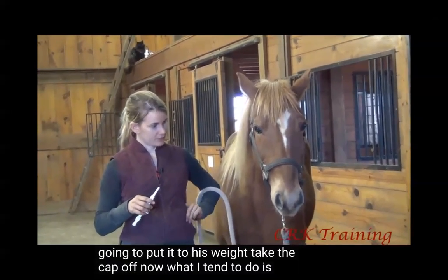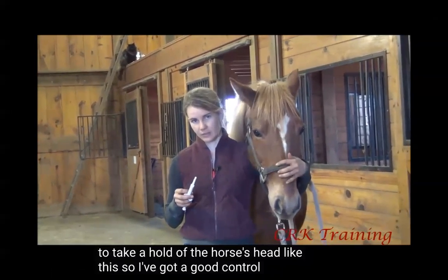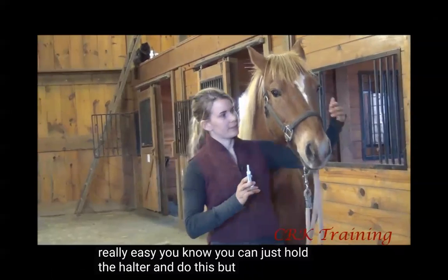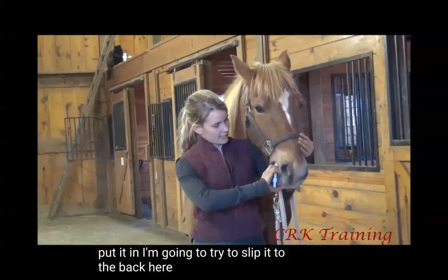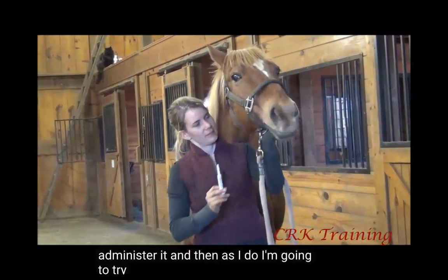Now what I tend to do is I tend to take a hold of the horse's head like this, so I've got a good control of their nose. If you've got a horse that's really easy, you can just hold the halter and do this, but I've just found that I'll do this, especially with a horse that's more difficult. I'm going to put it in, I'm going to try to slip it to the back here, administer it, and then as I do, I'm going to try to bring his head up.